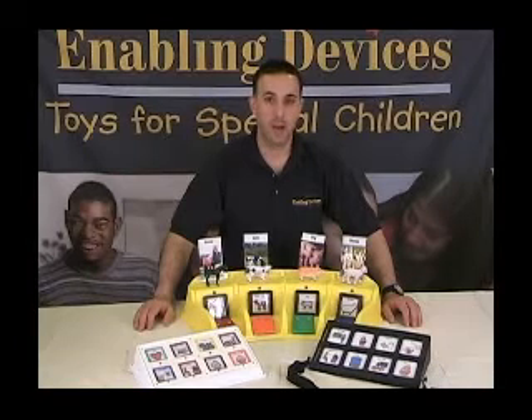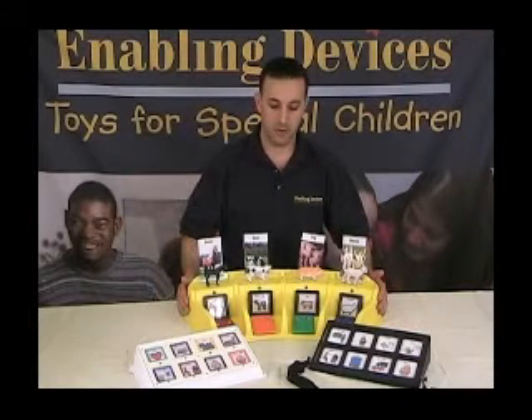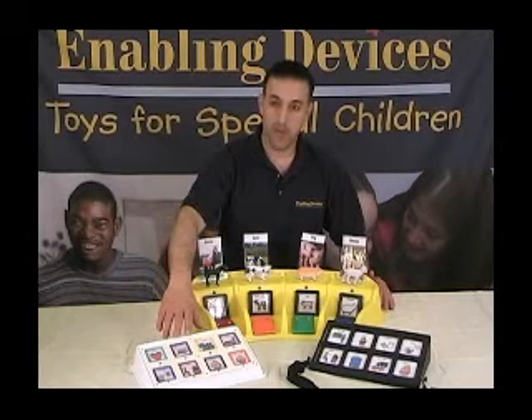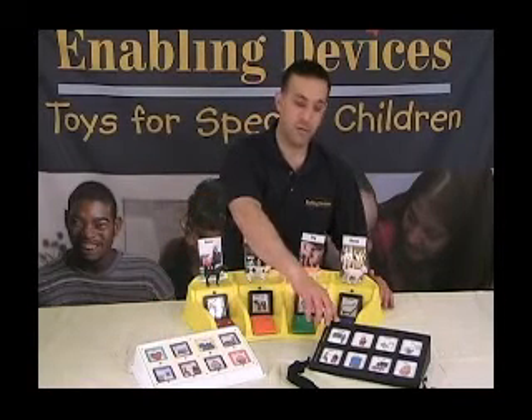Hi, Vinny Lovoti here, tech support for Enabling Devices. Today we're here to talk about some of our most popular communicators with scanning capabilities. We're going to go over each one individually: our super-sized communicator item 1221, our original Cheap Talk 8 item 3051 with scan, and one of our newer communicators, the Talk 8 2501 with 12 levels.